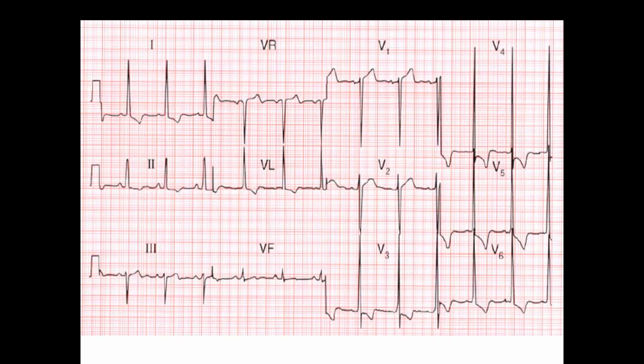This is the ECG for left ventricular hypertrophy. You can see that the S wave in lead V1, and this is the R wave in lead V6. And if you count the magnitude, there are 5 large boxes here and 5 large boxes here. So the total of these S wave in lead V1 and R wave in lead V6, the magnitude is 50 mm. So it constitutes the voltage criteria for left ventricular hypertrophy. Now your assignment is that you apply the second criteria on this ECG and see if it fits the criteria of left ventricular hypertrophy.